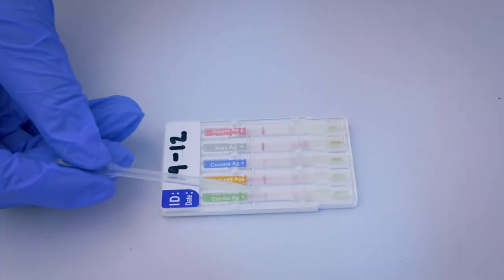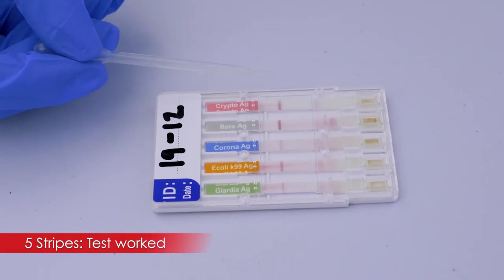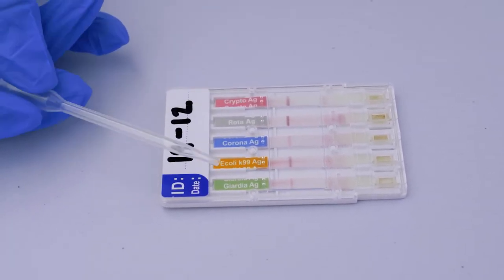This is your control stripe, and you want one ideally next to each of the disease names, which means the test worked for all five diseases. If this is your result after 10 minutes with only control stripes, it means that all the tests came back negative.